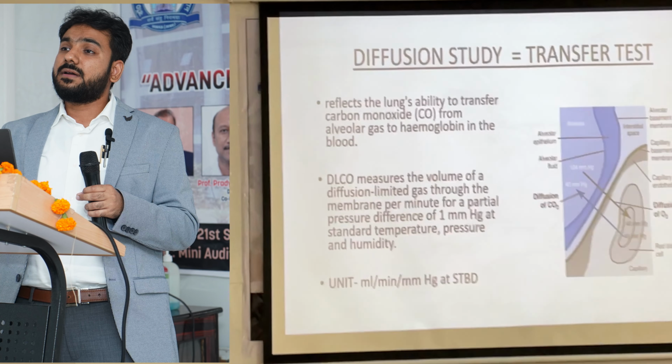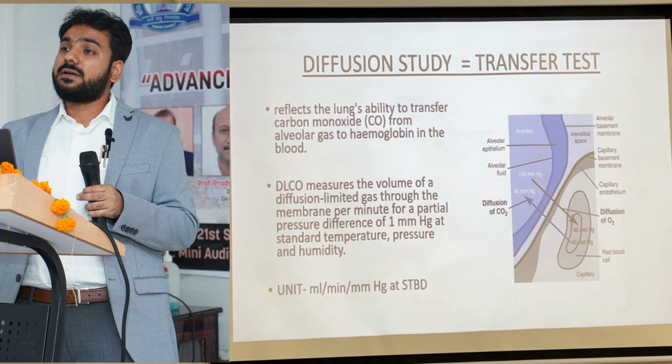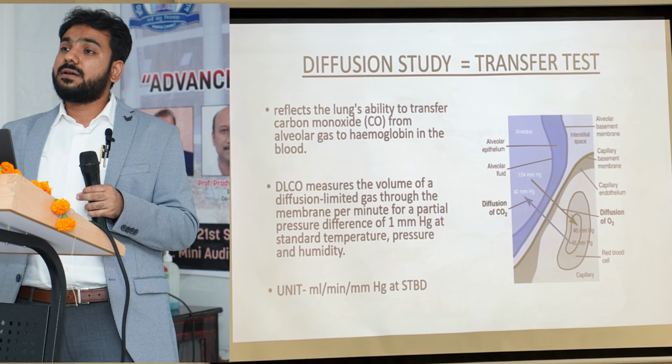Now the unit, since you have understood the concept, there is a gas, it is getting transferred. So we will measure it in terms of ml per unit time. The time that we are taking into consideration is 1 minute through 1 mmHg of partial pressure difference. The gas is only going to transfer when there is partial pressure difference. We all know that. So this is the unit, and STBD is standardization of temperature, barometric pressure and dry conditions. So it's not going to vary according to the temperature, humidity, altitude. So there is standardization.